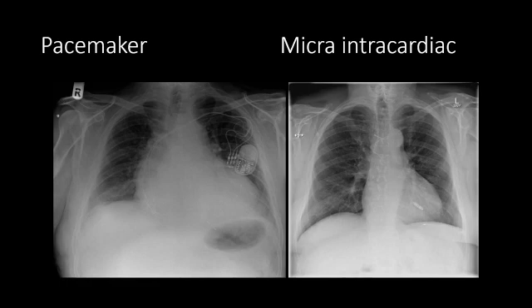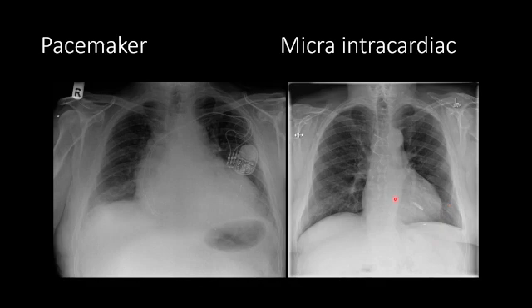On some patients you may see wires overlying the cardiac contour with no battery pack attached. Those are typically epicardial biventricular pacers used during cardiac surgery. The second image shows a leadless cardiac pacemaker, which is implanted into the right ventricle. As the name says, it has no leads, and this should not be mistaken for a loop recorder.